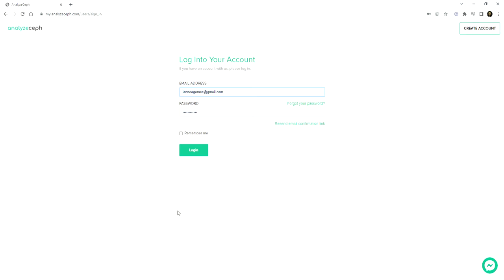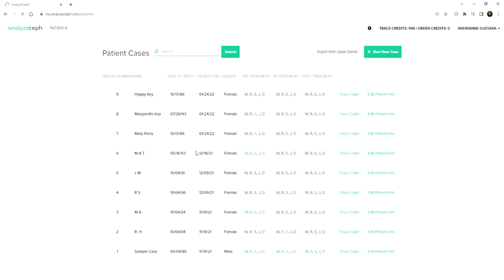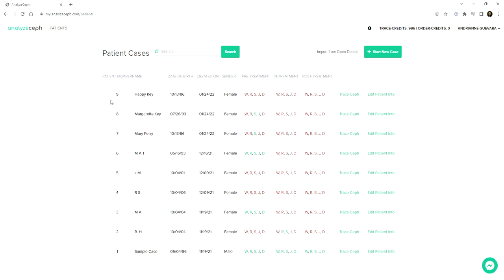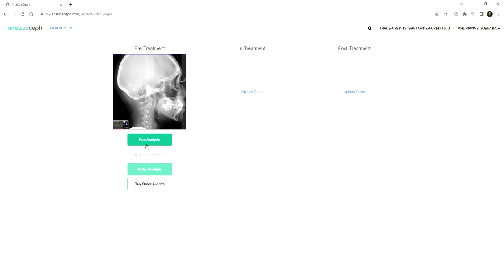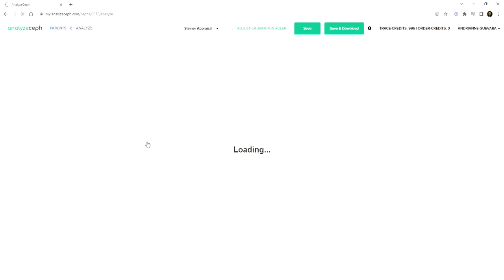I'm going to show you how to do the Steiner's analysis on Analyze CEF. First, you need to log in, and on your patient cases, you may choose to start a new case. I already uploaded the CEF of my patient, so I'm doing patient number 8. We're clicking Trace CEF and doing the pre-treatment, so let's run the analysis.